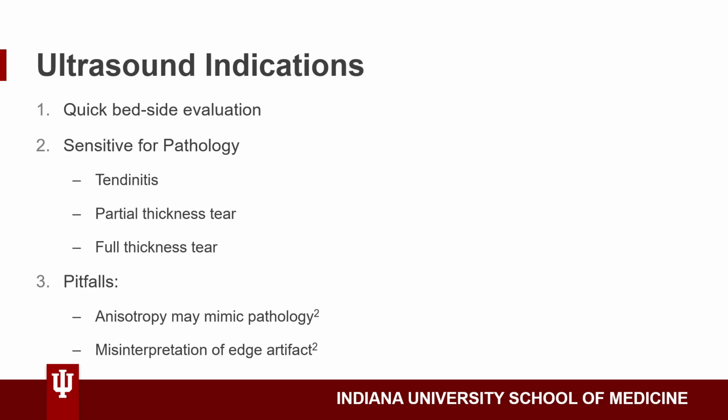Ultrasound can be an invaluable tool for physicians, as it's a quick bedside evaluation that's relatively inexpensive. Additionally, ultrasound is sensitive for pathology, and providers can discern between tendinitis, partial thickness tears, full thickness tears, bursitis, and other pathologies. However, there are some pitfalls with ultrasound.